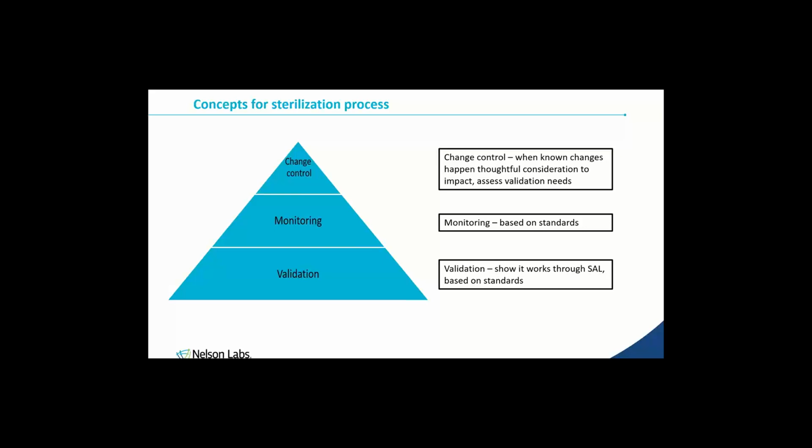Then once we've validated our product and our sterilization process, and we have the sterility testing that goes with that validation, we're then going to use it as prescribed by our various standards or pharmacopoeia for monitoring purposes. So we do the test of sterility to monitor product and to ensure that it is compliant to what we're trying to do. Finally is going to be our change control.